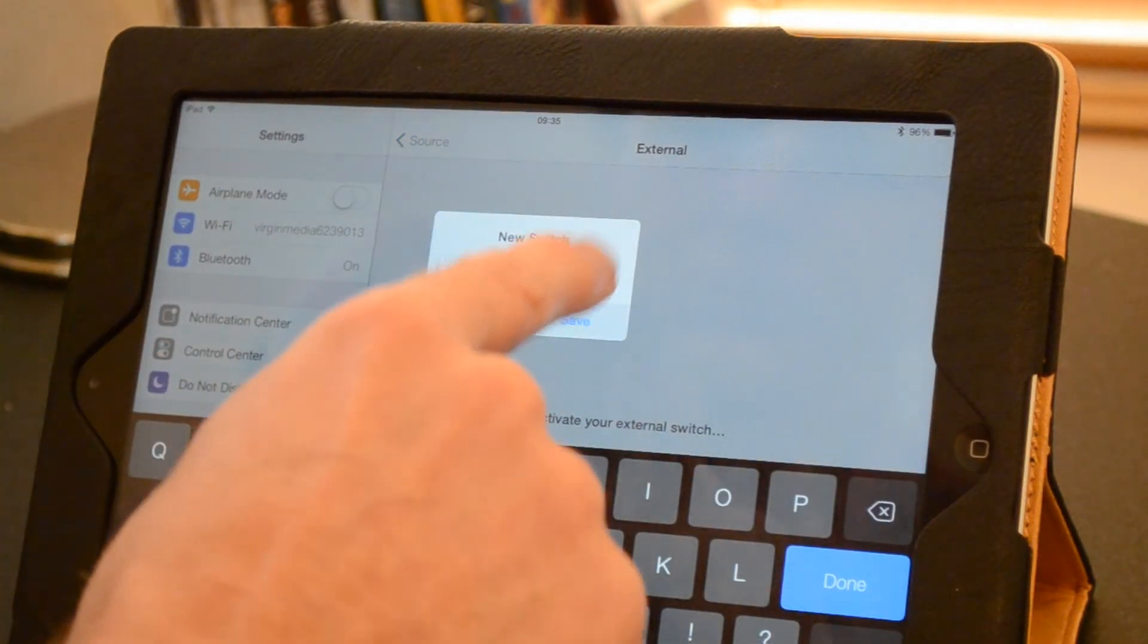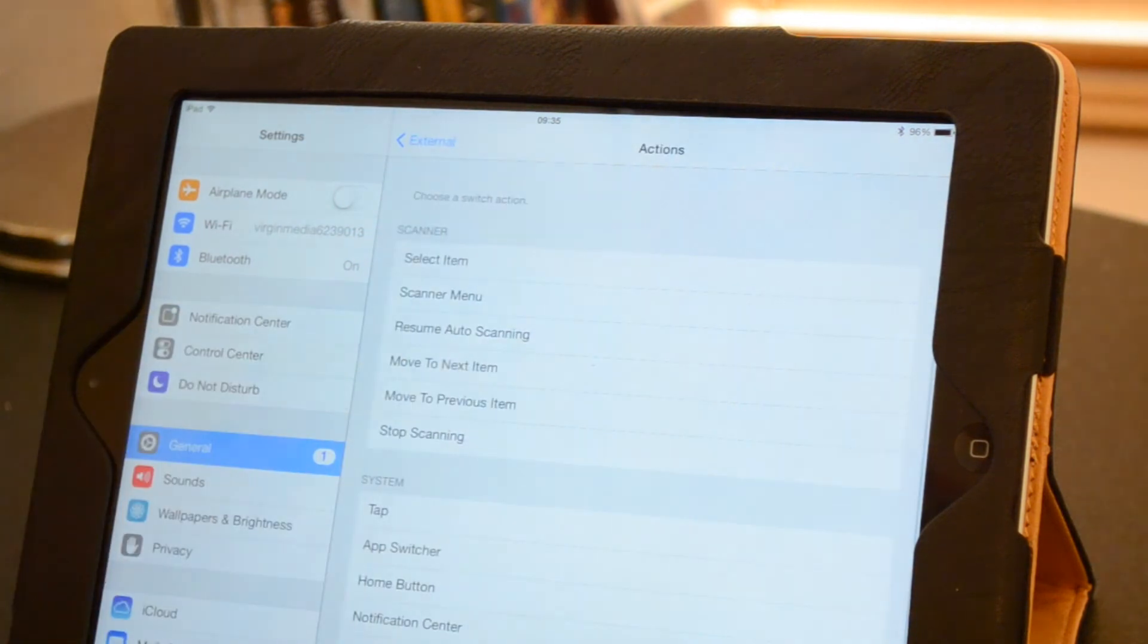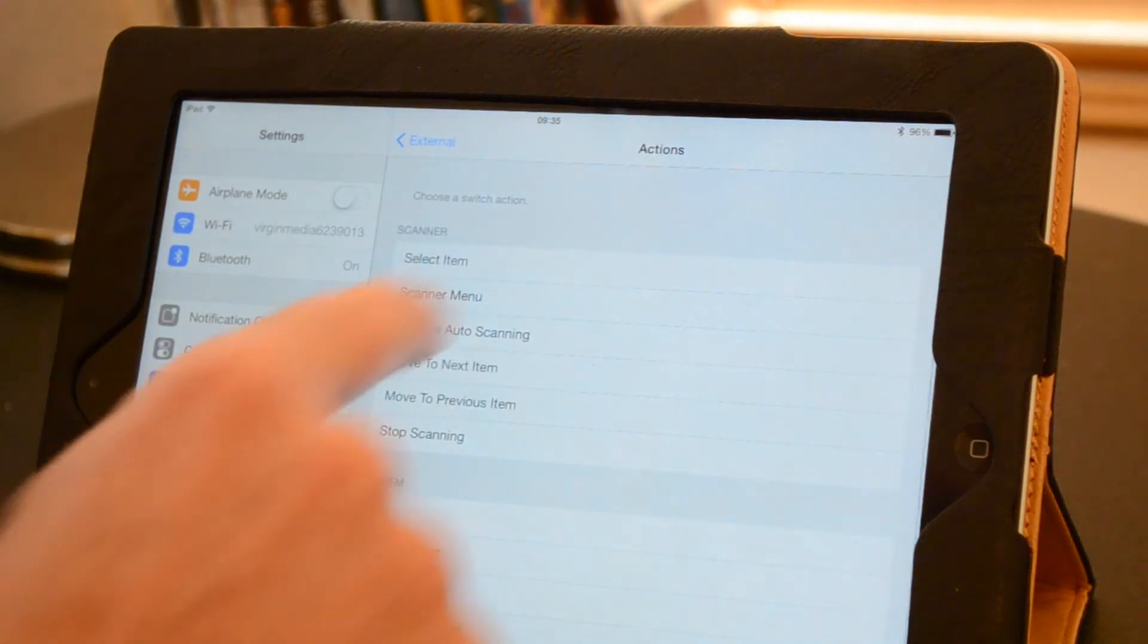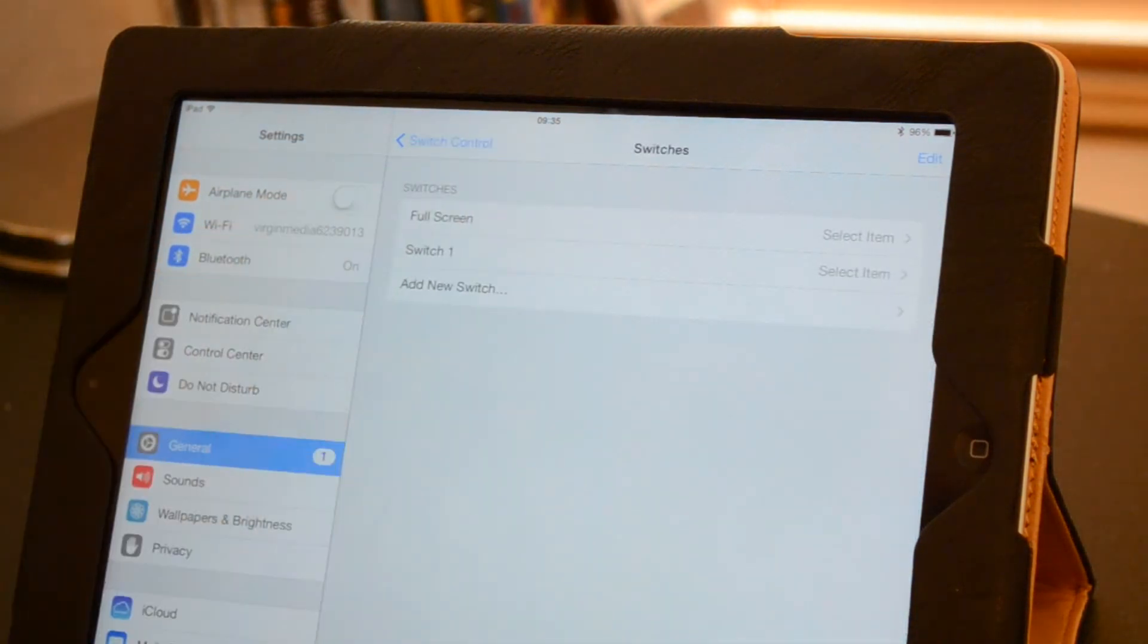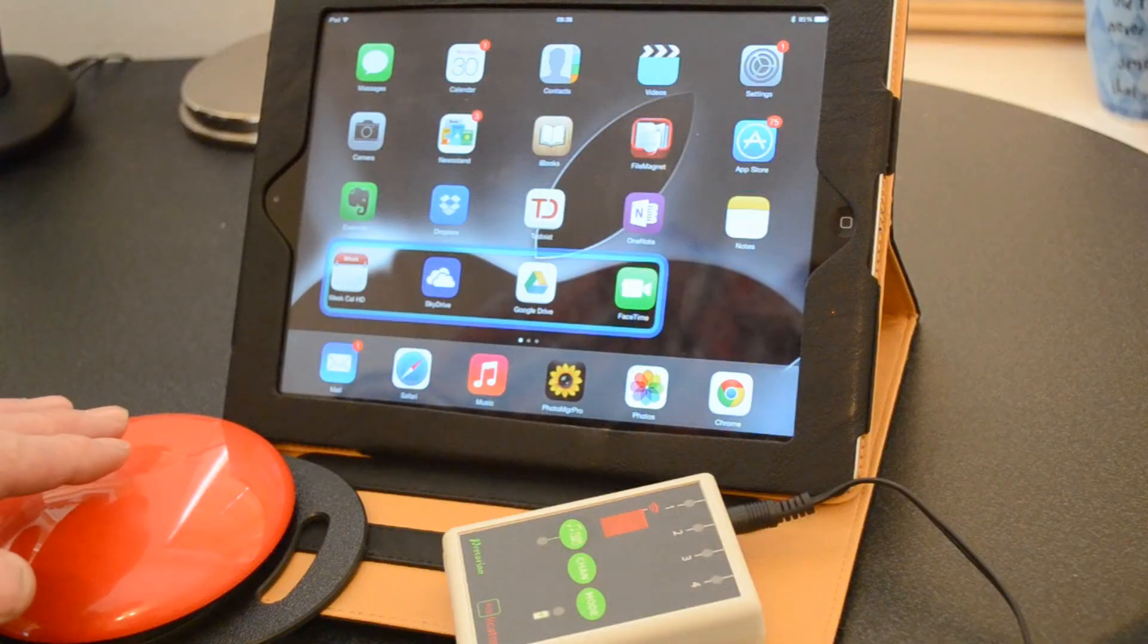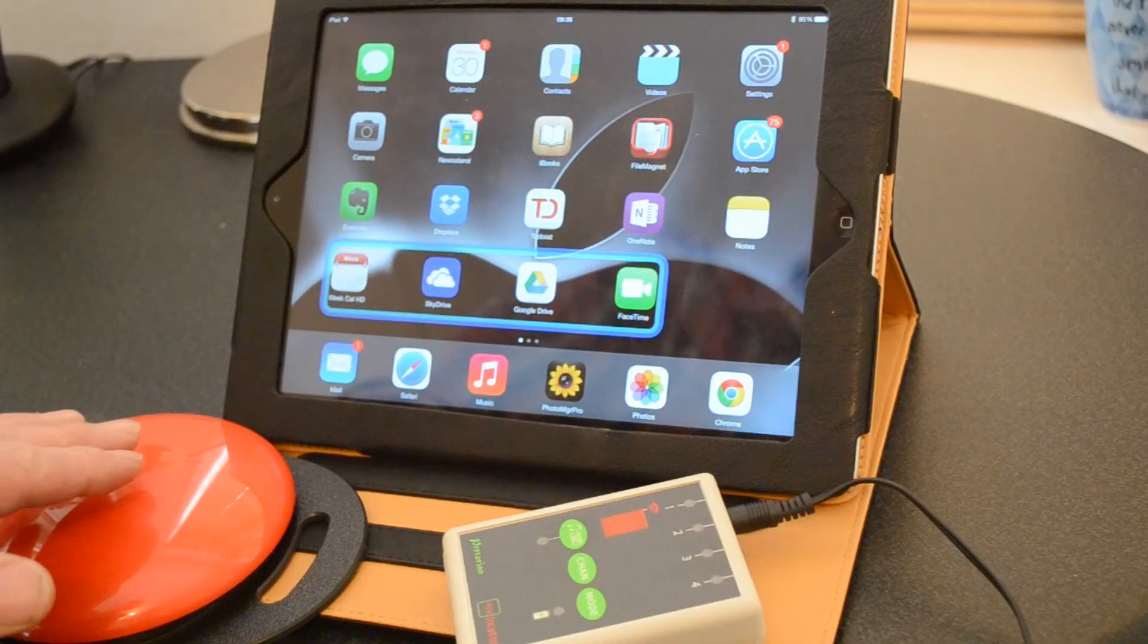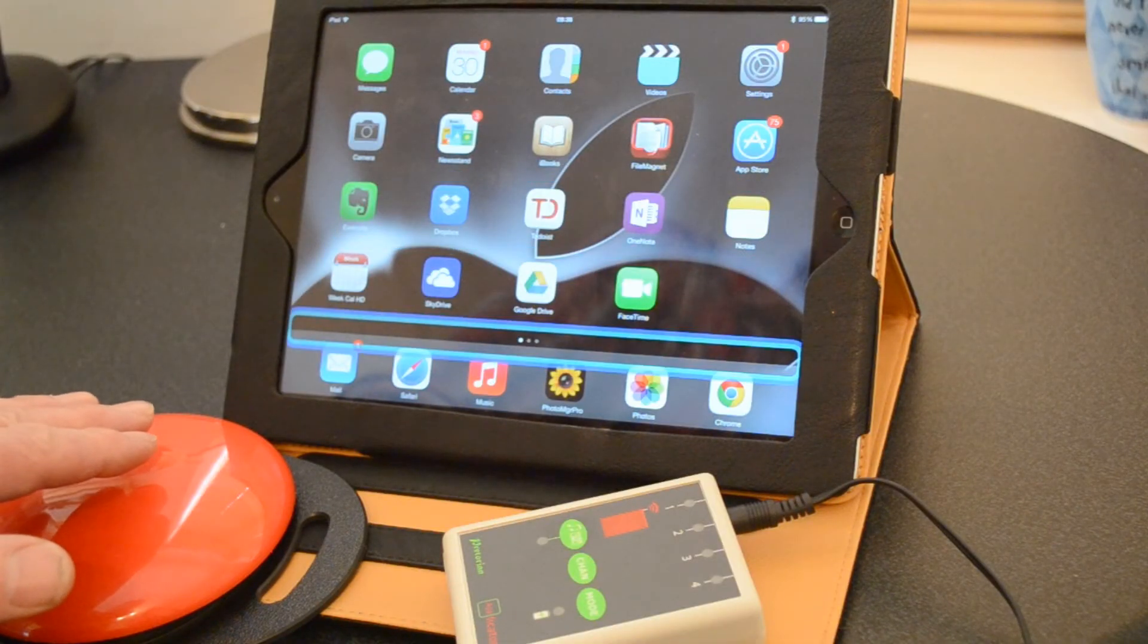Here I'm activating the switch so that the iPad recognizes it. And then I'm using the group scanning method to select a song.